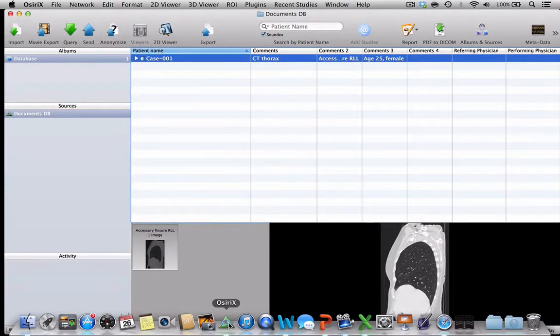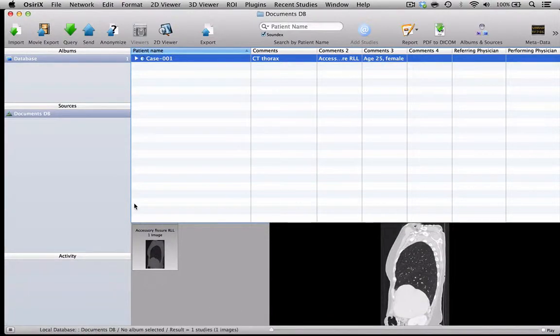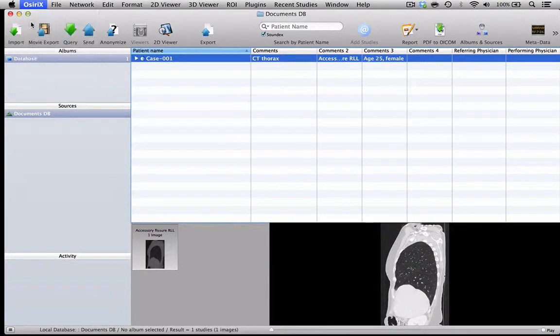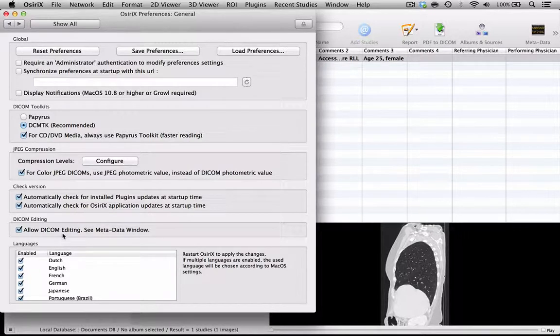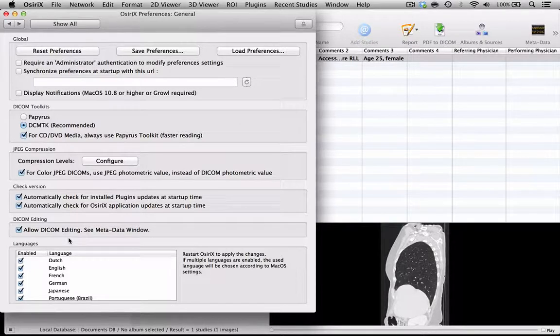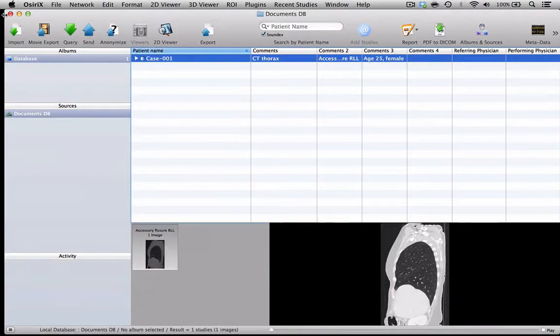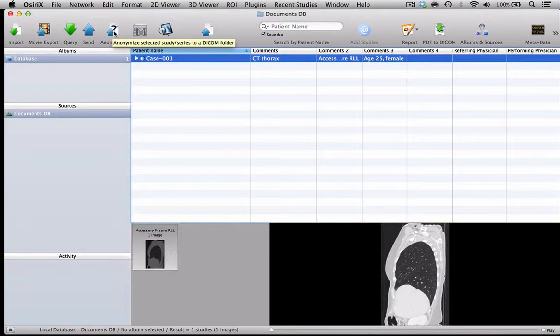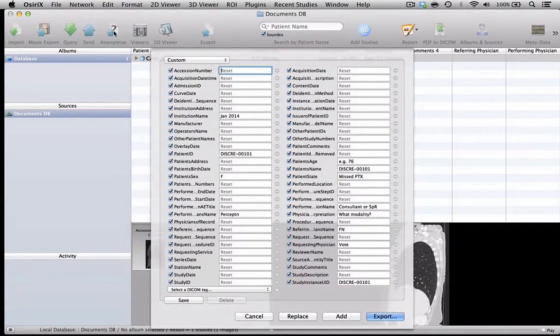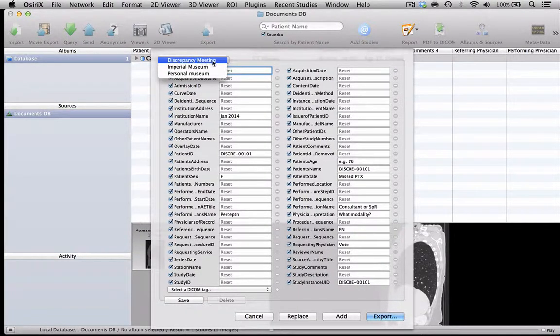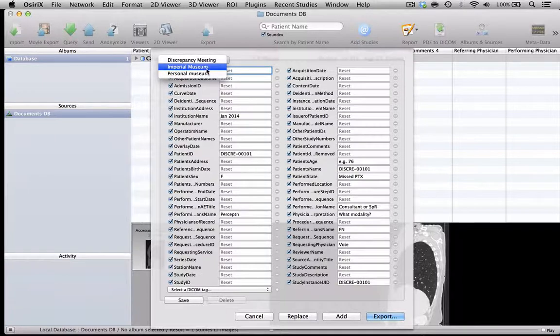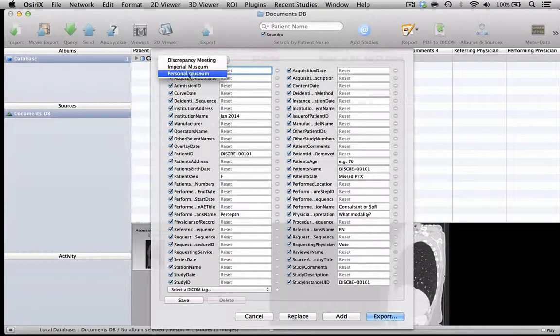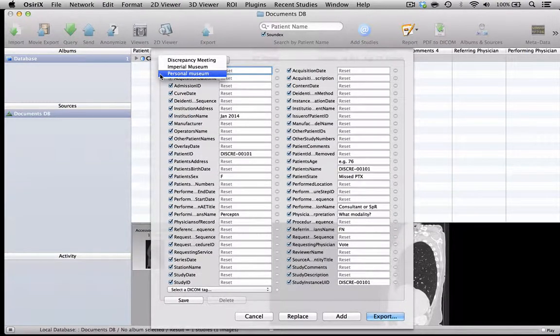So now my new preference settings hopefully will have been applied. If I go to the OSirX menu and look at the General Preferences, I will see that now DICOM editing is allowed, which is one of the things that we need for teaching. If I look at my Anonymization Protocols, you will find that the default protocols that I have put on for our teaching purposes in our department are all available - the degree of anonymization that we use for the discrepancy meeting, for our departmental museum, and for the individual personal museums have all been uploaded onto the preference settings.